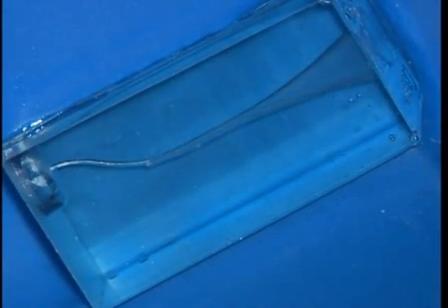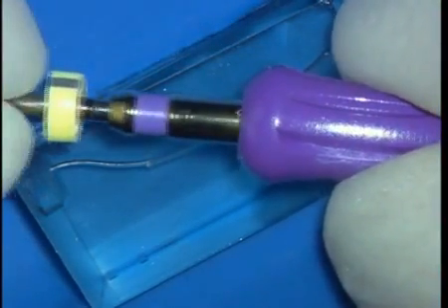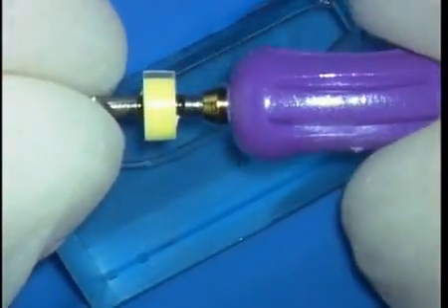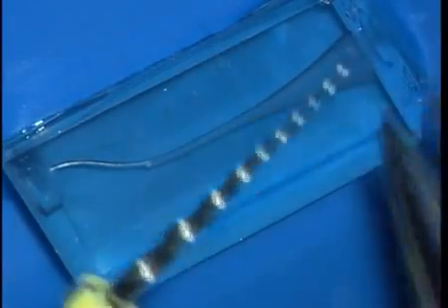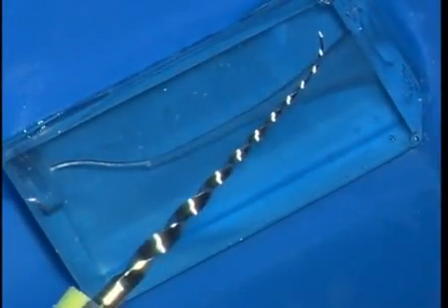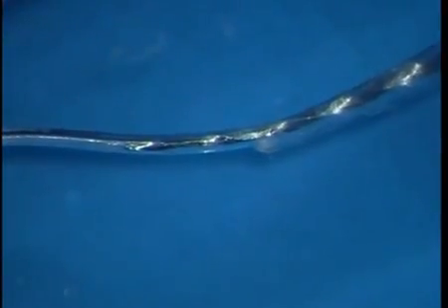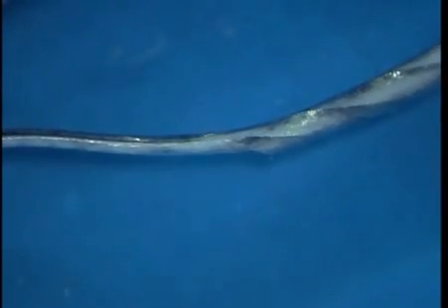Well, we've worked a 10 and 15 hand file to length until they were loose, but the ledge is still present. Let's look at ledge management. As we saw earlier in the show, we can take a rotary ProTaper instrument and convert it to a manual file using the snap-on handle. A bird beak plier can be used to put a nice rolled radius curvature on the terminal extent of the instrument. By reciprocating the handle of the file, we can walk the tip of the instrument and bypass the ledge.